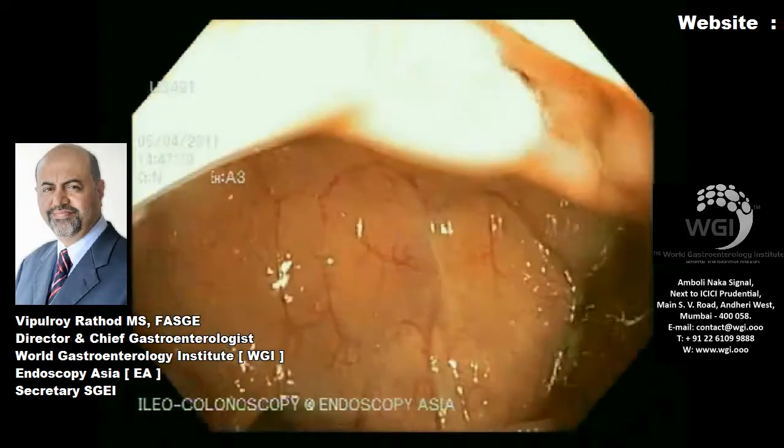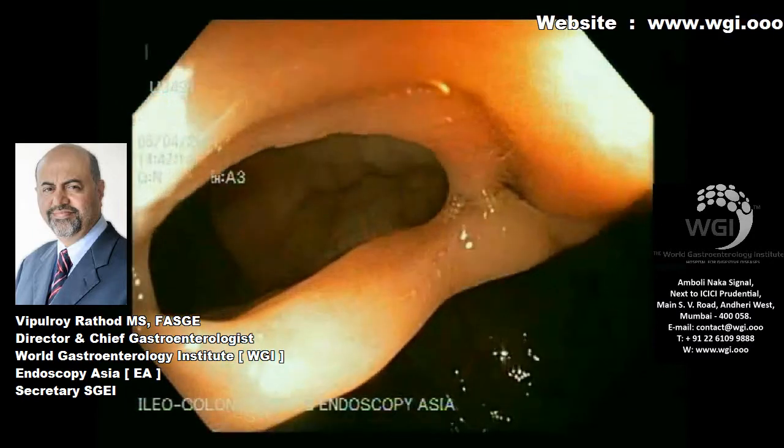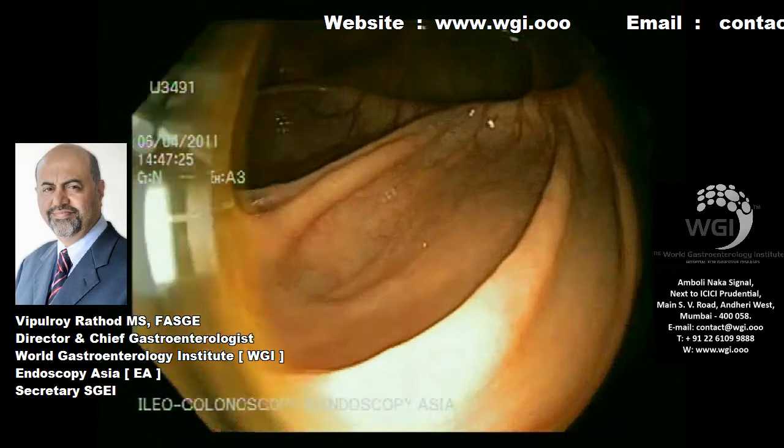A 48-year-old lady was referred to us for ileocolonoscopy. You can see the terminal ileum here, and this is the cecum. You can see the appendicular opening at the 10 o'clock position.